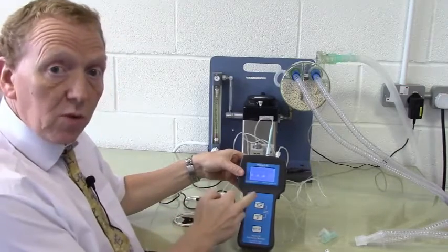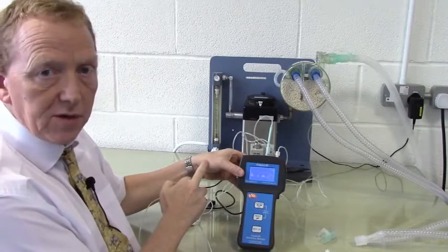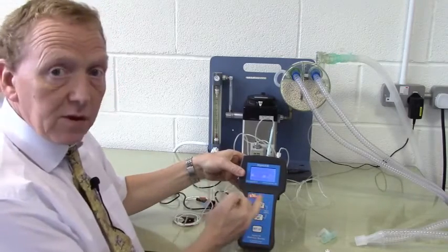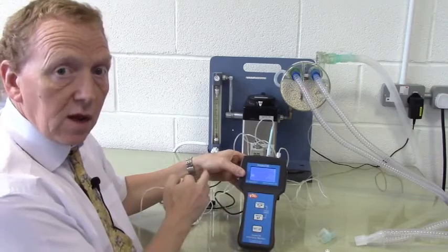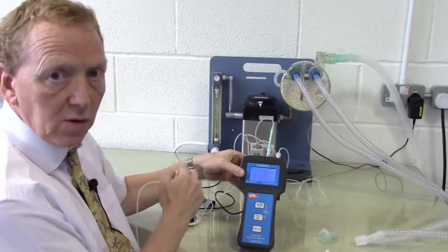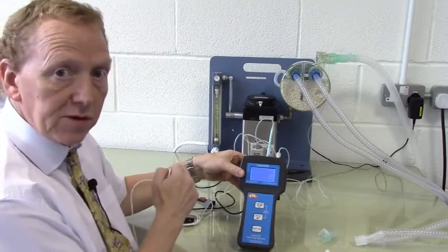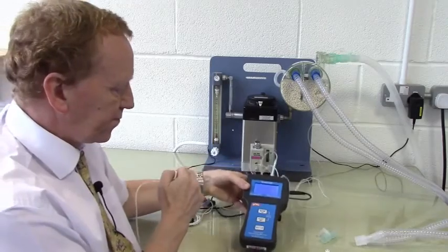So we have nice normal waveforms with plateau phases, and we have an end tidal of 32mm of mercury. Easily configurable, this can be changed to percent as you wish. The line may also be set as fill or just a straight open line, depending on how you prefer to view the CO2 waveform.